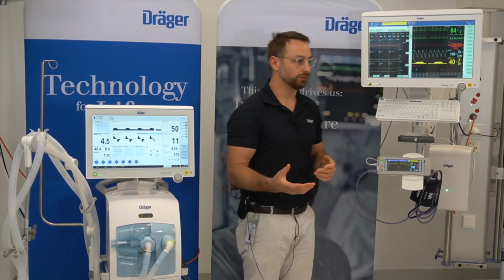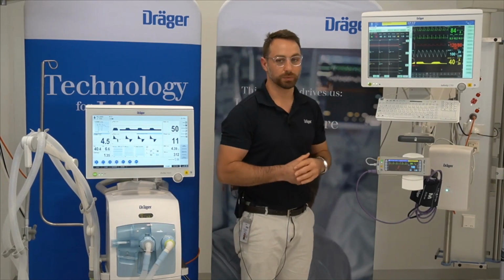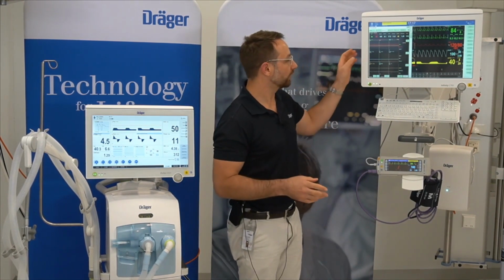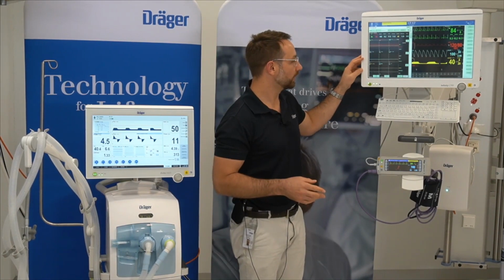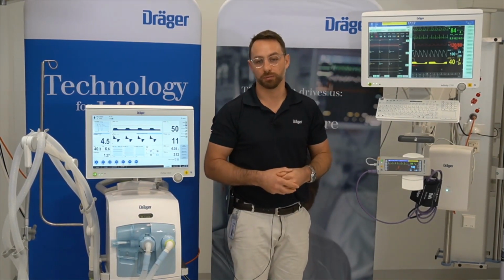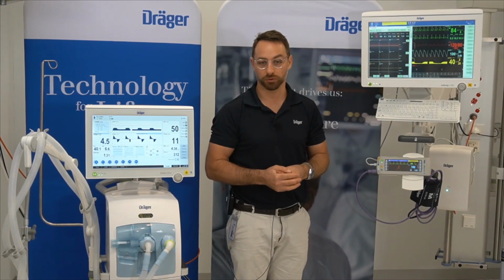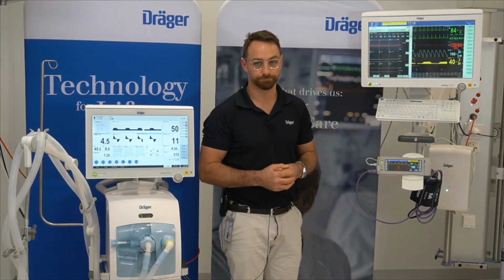An example I might give is during a recruitment manoeuvre, a clinician can see straight away whether their mean arterial pressure has dropped due to the pressures of the ventilator being too high during the recruitment manoeuvre. They can also see whether the PIP or the PEEP has been set accordingly in relation to the dynamic compliance. SpO2 is another great parameter to look at during a recruitment manoeuvre. Has the SpO2 increased during or post the recruitment manoeuvre, indicating what could be a very successful recruitment manoeuvre in itself?